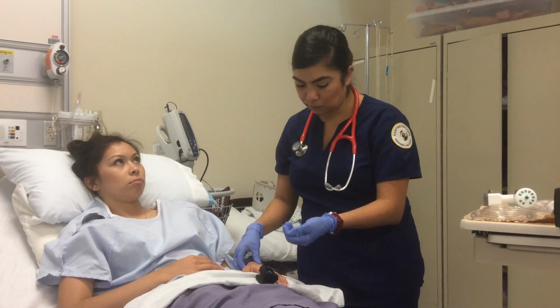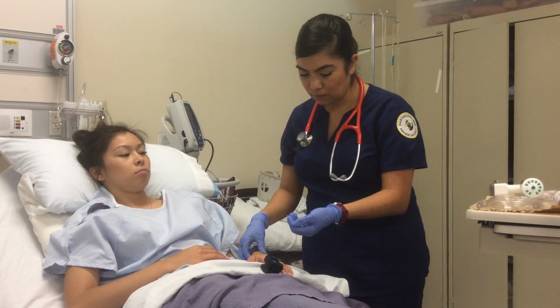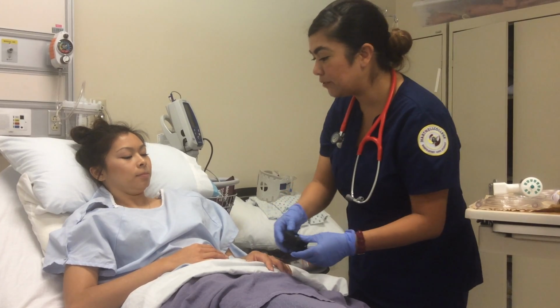The treatment is about 10-15 minutes long. So I'm going to turn it on, and we're going to check to see if mist comes out, and when it does, you're good to go, okay? Very good. Thank you very much. Let me go ahead and remove this.